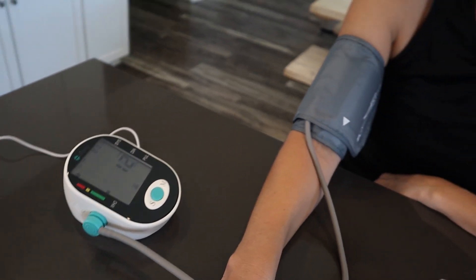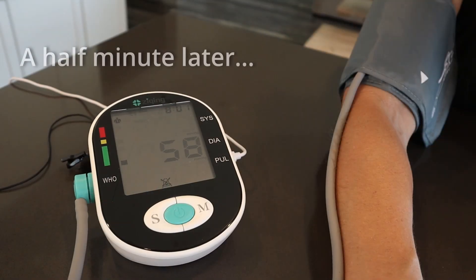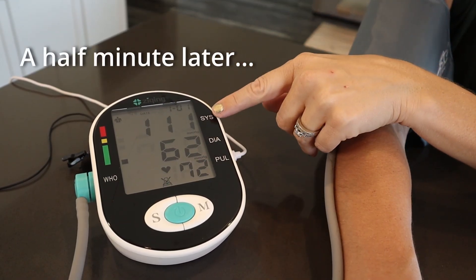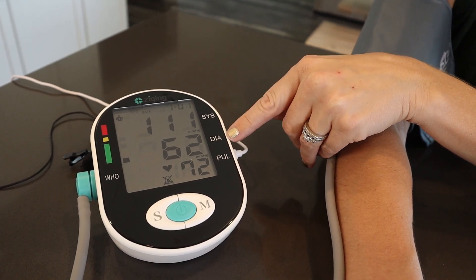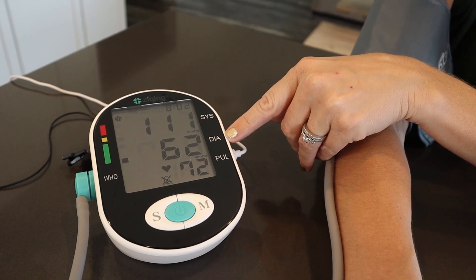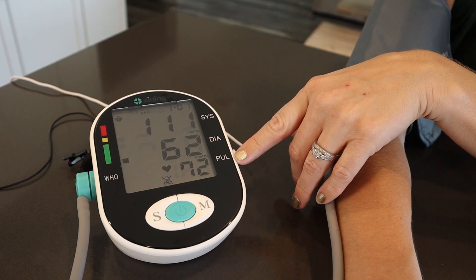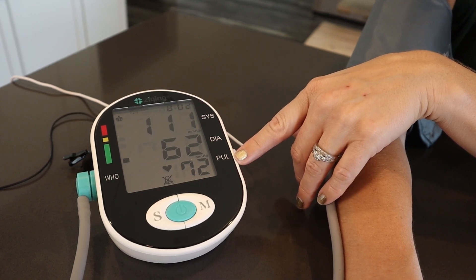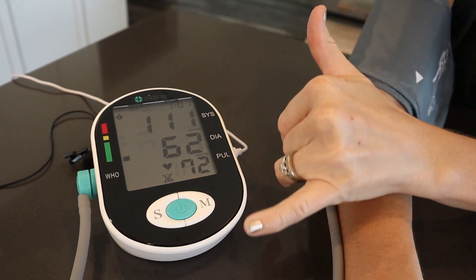We're going to give it a minute here while it does its thing. [Voice broadcast]: Your blood pressure is systolic pressure 111 millimeters of mercury, diastolic pressure 62 millimeters of mercury. Your pulse is 72 beats per minute. Measuring result is normal. Thank you, wish you good health.